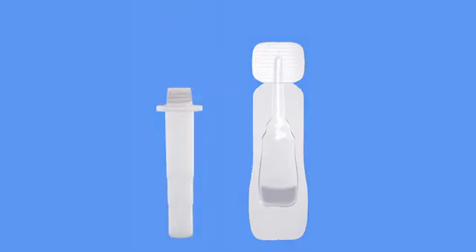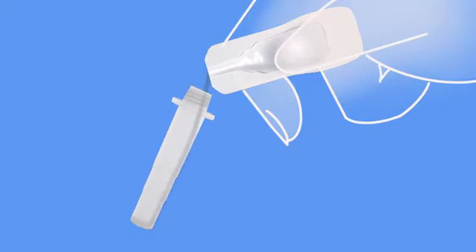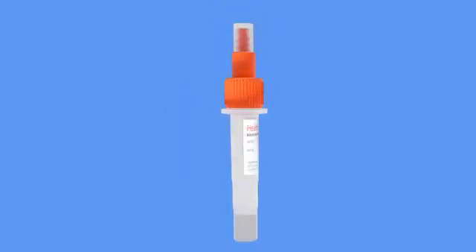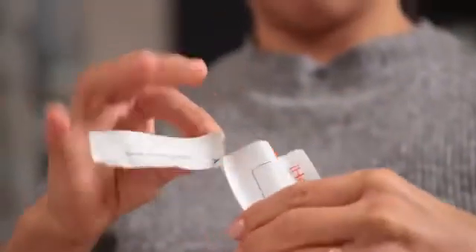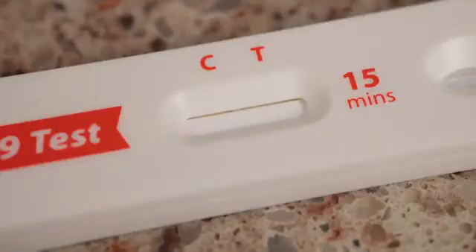Remove the larger lid and then carefully tear off the top portion of your solution packet. Pour the entire contents of the packet into the tube. Careful not to spill. Now, put the lid back on the tube and you're ready to go. Tear the foil packaging off your test card and lay the card upright so that it's ready to receive your test solution once you've taken a sample.